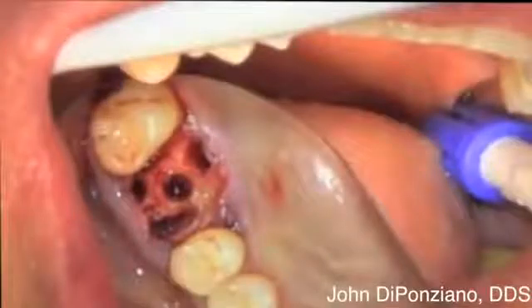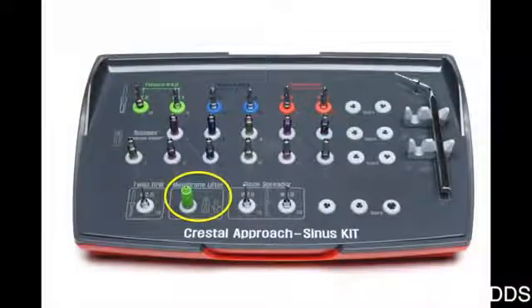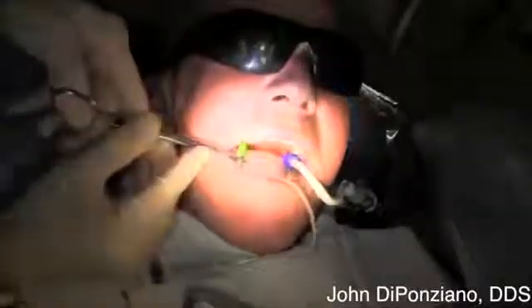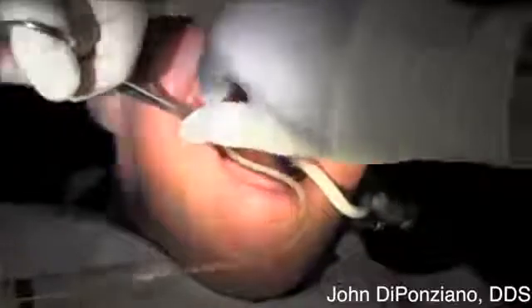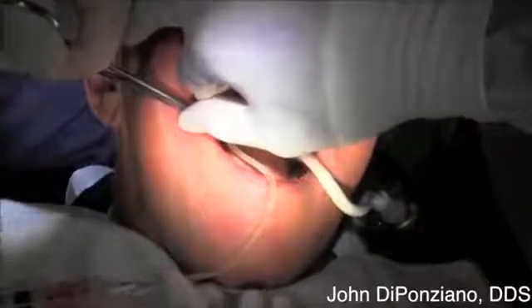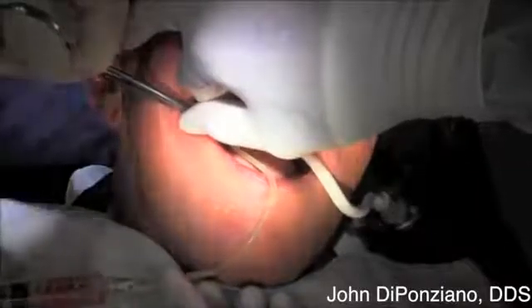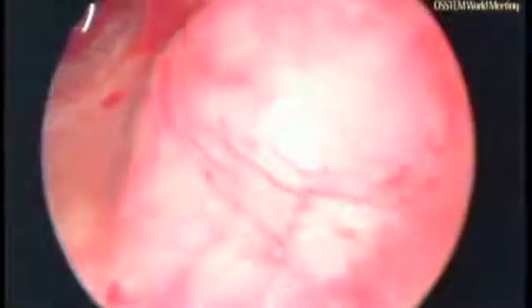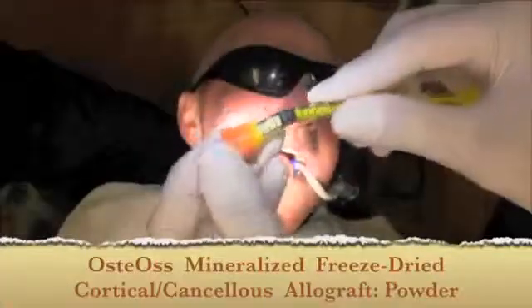You can see the difference in close up — there's some bleeding because I'm actually through, but I haven't perforated the membrane; I can feel that I'm through the bone. Now I'll use the membrane lifter, which is an autoclavable silicone attached to a saline syringe. This is soft so it seals up into the osteotomy. Once I have it placed, the assistant stabilizes it, and then using 0.5 cc increments I will inject up into that and raise the sinus membrane. The first increment is 0.5 cc done twice, followed by 1 cc also injected twice, and we withdraw the saline after each injection. This is a view done through a lateral endoscopic window at the 2011 World Symposium by Dr. Cho, showing how it lifts the sinus membrane.